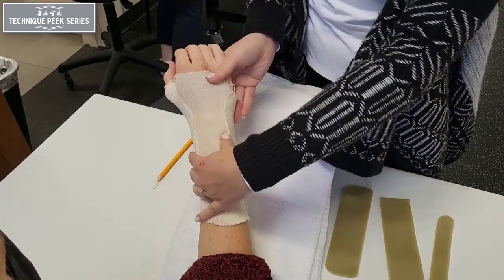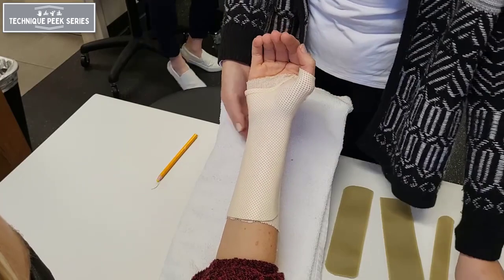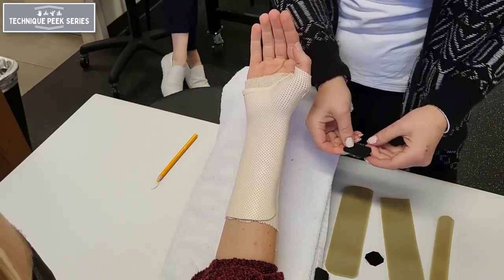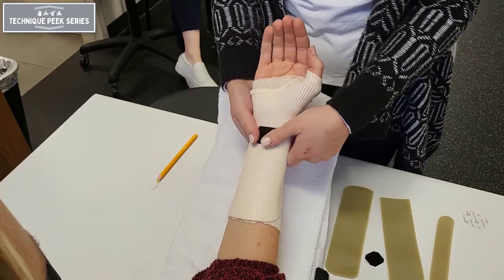Next, apply the velcro straps. We want one strap around the wrist crease, one strap proximal to the wrist crease, and the last one securing around the back of the hand.